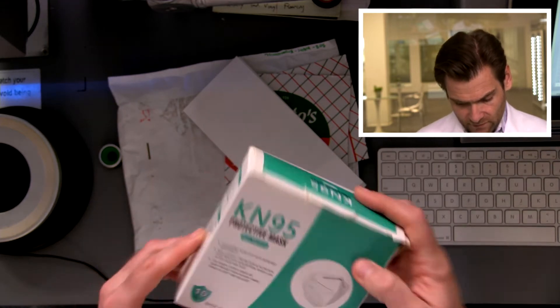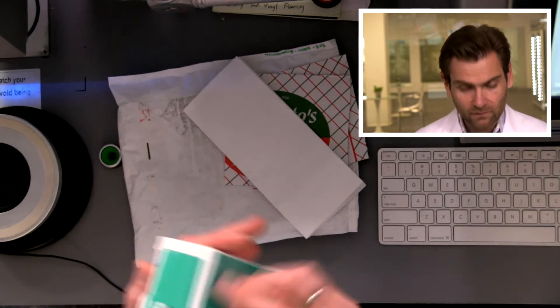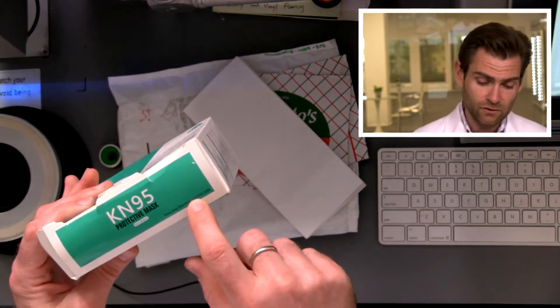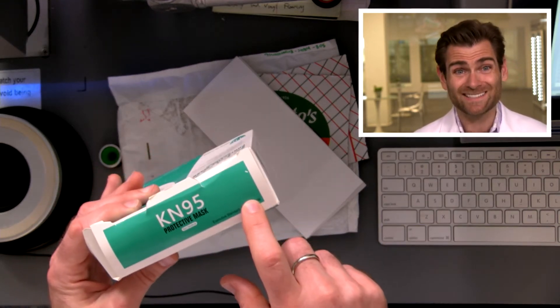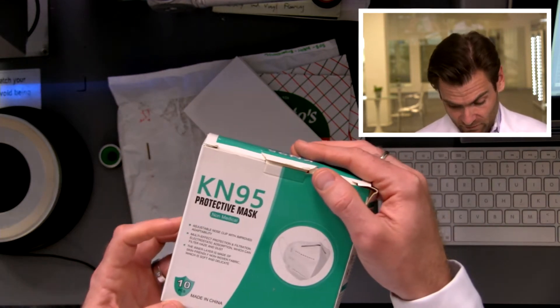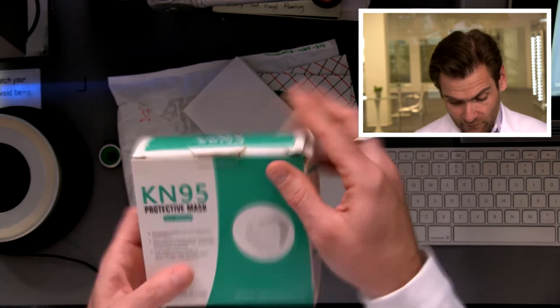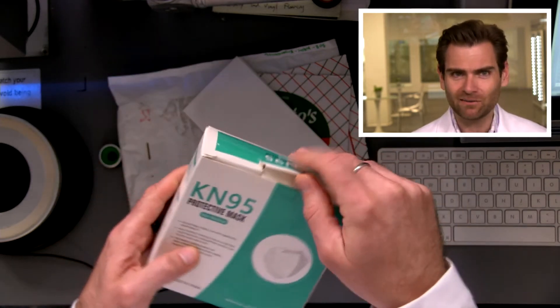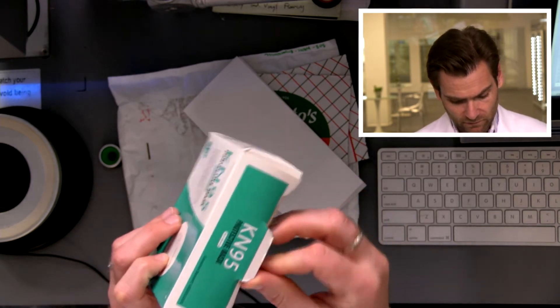It's basically illegal to claim compliance with GB 2626 — which is the Chinese KN95 standard — and not put the manufacturer name on the box. There's no manufacturer name on this box. In fact, when we first saw this, we asked: is the name of the manufacturer 'Ergonomic Design'? I don't think so. All right, let's open this up.